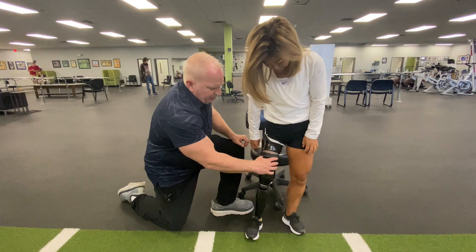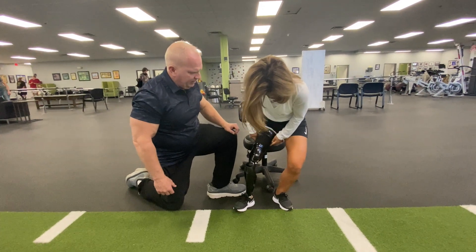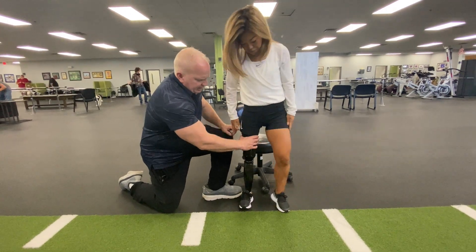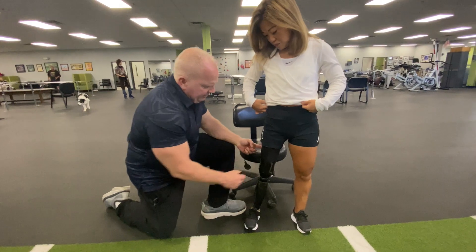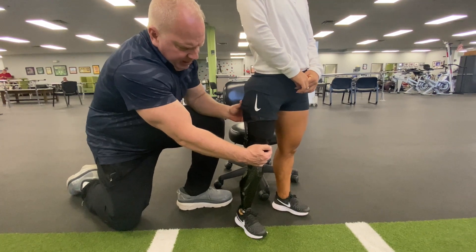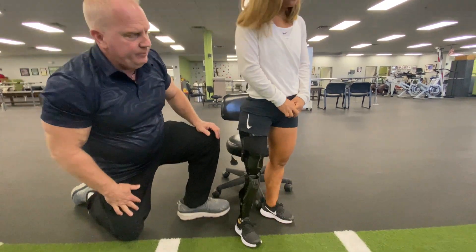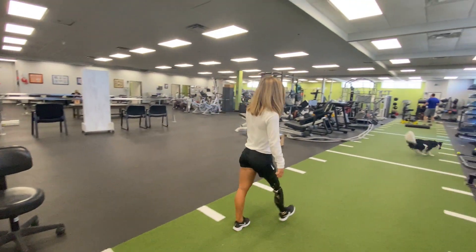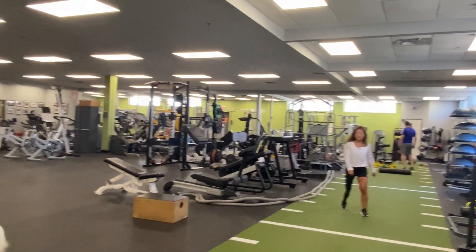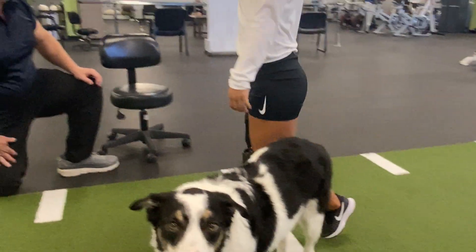Once she's in the socket, she's able to pull up the sleeve. The sleeve makes contact with the liner causing a seal to take place. Scout, being an amputee that can partially load at the bottom, can actually fire her quads and hamstrings. The strut isn't just a straight carbon strut — as she's walking and pulling over the top of the toe, this bend is straightening and releasing energy. Let's go ahead and walk down through there. Perfect. We'll show the running prosthetic she has in a little bit. Thank you, Scout.